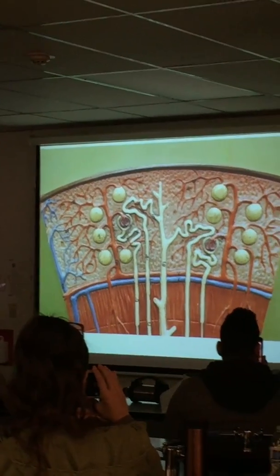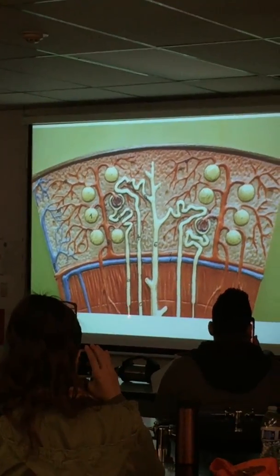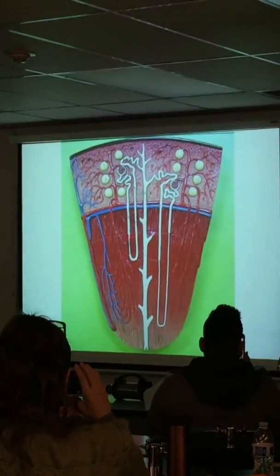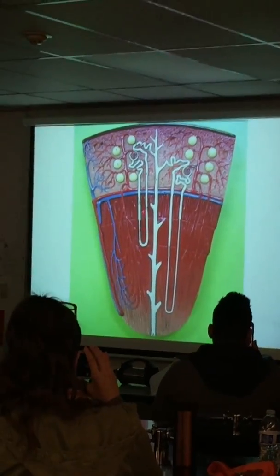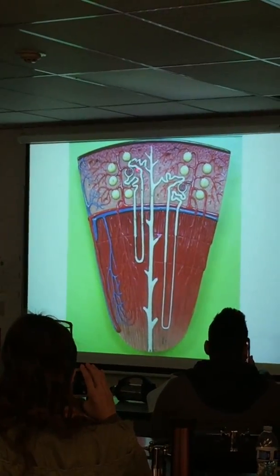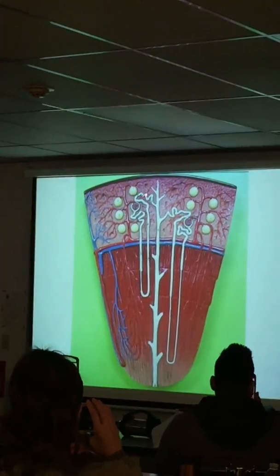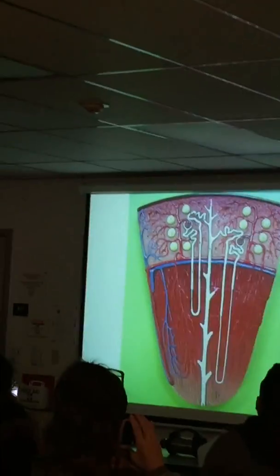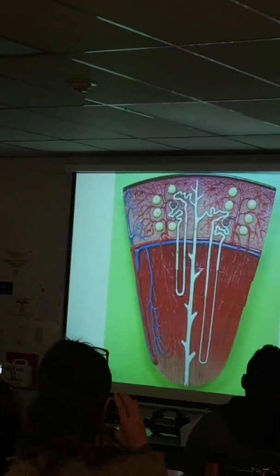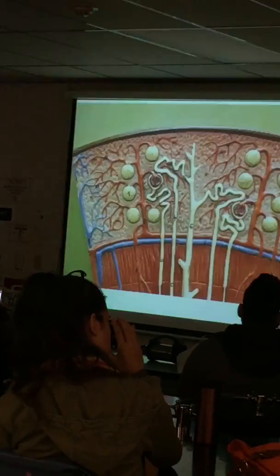If you follow the nephron parts, it goes tubular pole, which is PCT, and there's the thin descending limb there. Follow down there. There's the thin descending limb, and thin descending and thick ascending. And then right around here, call it DCT. It passes by the vascular pole, then drains into the collecting duct. Okay, so we're going to call these capillaries peritubular. And the ones down here, vasa recta.